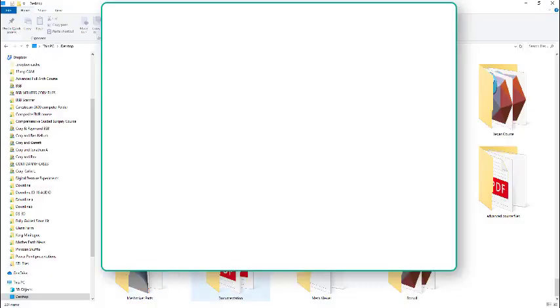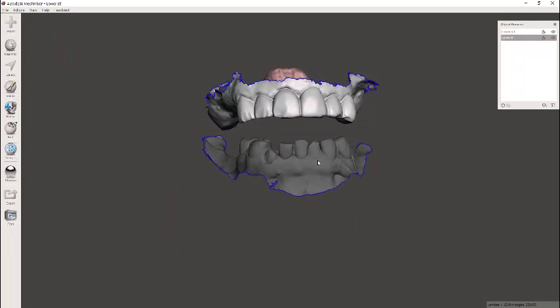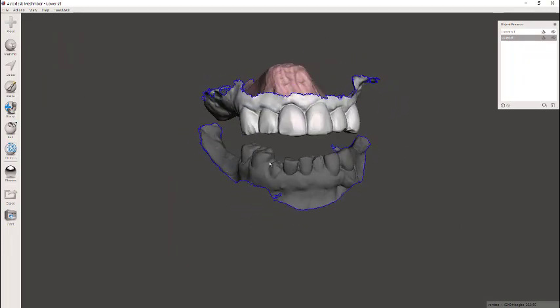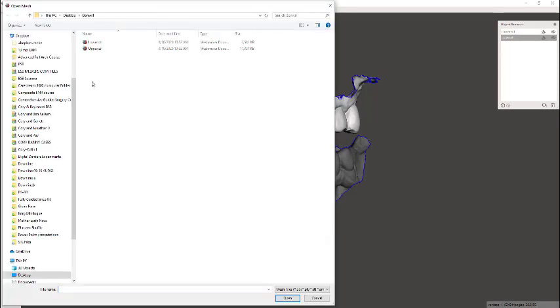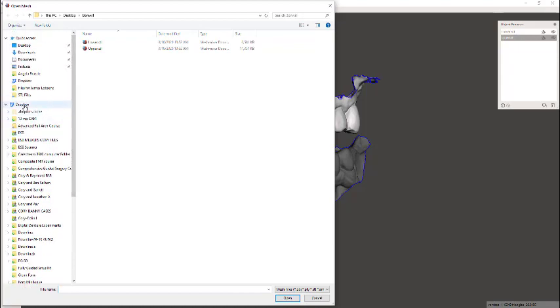And now I'm just going to open both of those files in Meshmixer. Okay, we have two STLs here. We're in Meshmixer. Now I need to import the STL. This again is the thing that I'm demonstrating. So I need to go to import, append. Append just means add it to the case. Don't replace a model. And now go to wherever you've saved the download for this STL.